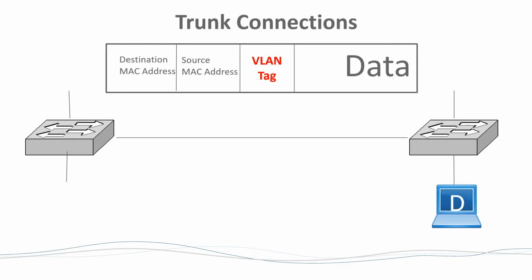So the interesting thing is I can carve up a couple VLANs here, right? And this is how it works in IT. You say, hey, there's this really neat thing we can do. And they're like, oh yeah, but can you do it different? Sure, yeah, we'll do that too. So we can take another switch and carve it into network A and B as well. So I can have network A, B here, and I could join them together by running a cable between A and A, and B and B. Do you see how I join those networks together now? And now I have A in both places and B in both places.